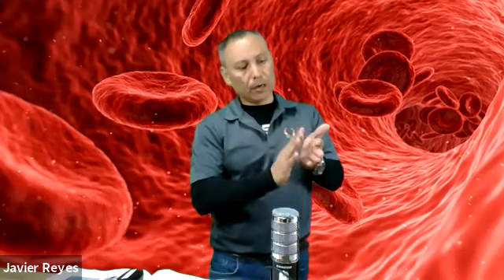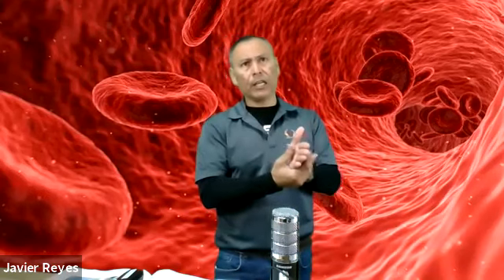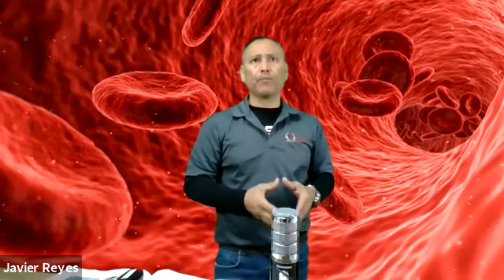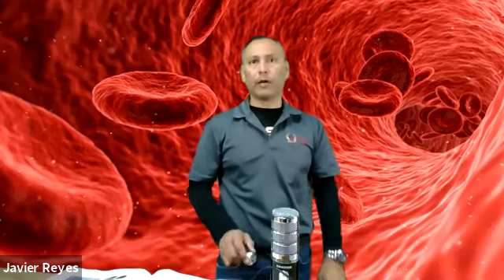If you have good arterialized blood, if the site is warm, you should not have any problems collecting your specimen. So again, make sure you warm the site. Wrap the site for about 3 to 5 minutes, probably not more than that. You can use a moist washcloth if you don't have one of those pre-manufactured kits, a towel, or even sometimes a diaper can work. Clean and air dry the site with your normal antiseptic, which is isopropyl alcohol. Allow it to air dry. Do not blow dry, fan dry, or pat dry. You must let the antiseptic do its work.